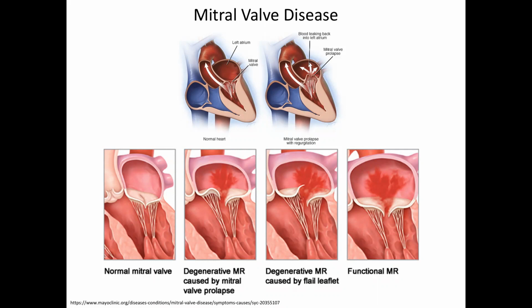Nowadays, also in the bioengineering fields, people have come up with minimally invasive mitral valve devices, which are put in without cracking the chest and exposing the heart.